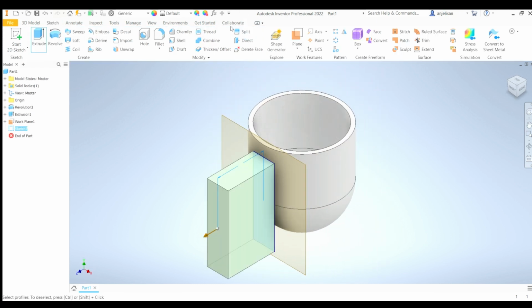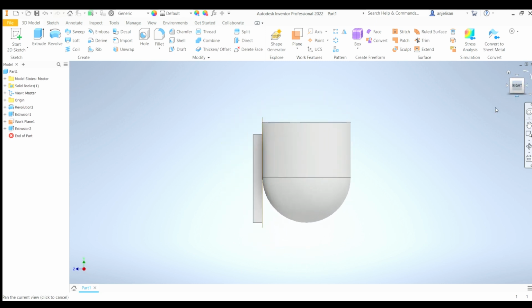Let's extrude this feature so that it's a 3D feature. Let's say, I don't know, it's not that thick. Let's say 25 inches. Let's say 35 inches. Yeah, why not? Make sure it's extruding in this direction. So now we have our little bar part here, like how we have this straight part here.